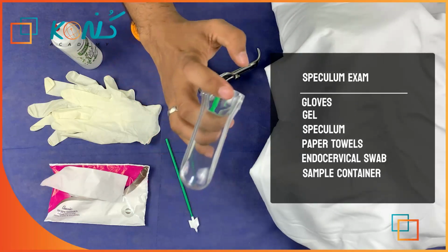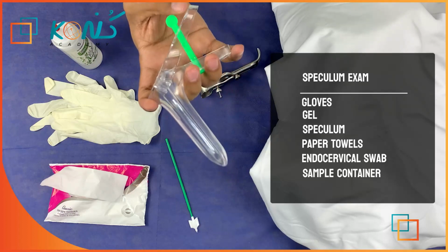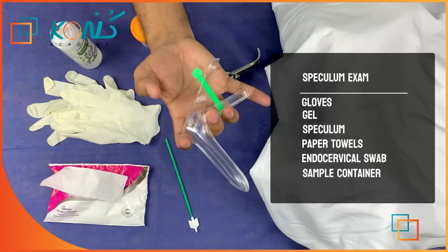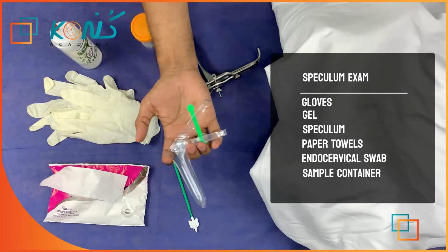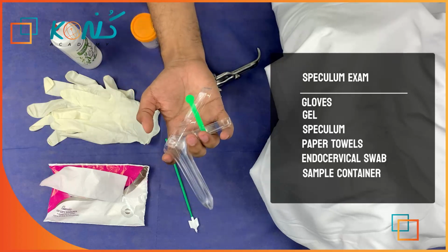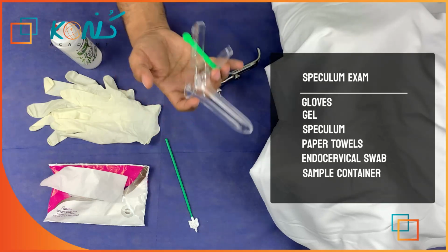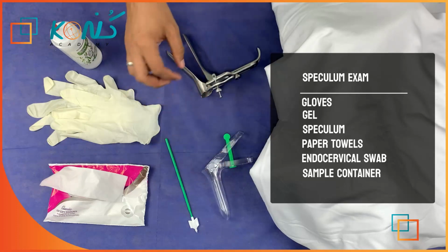Before starting your examination, this is the ideal way to hold the speculum, either the metal one or the plastic one, to hold it like this. I hope this point is clear for you, right? To hold it like this, okay? And we will see together, while we are using either the metal or the plastic one, how we are inserting it and what the steps of doing our speculum examination and getting the cervical sample are.